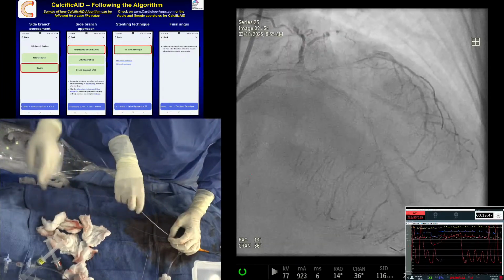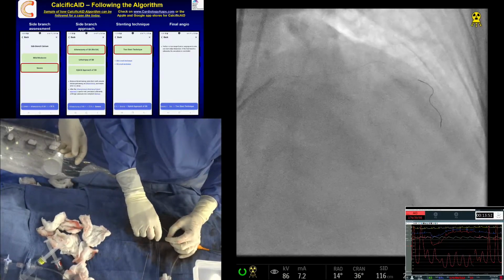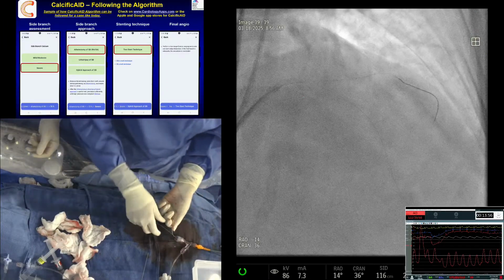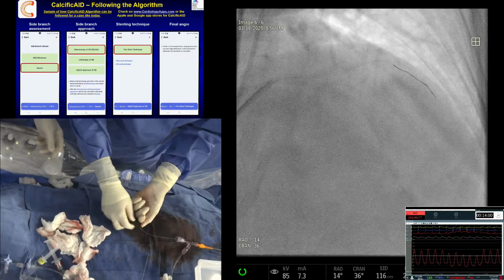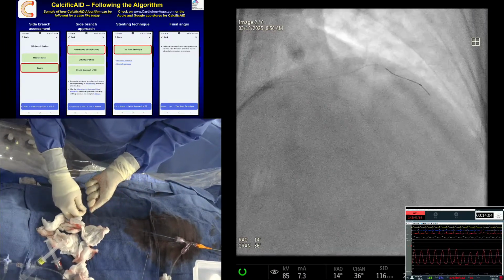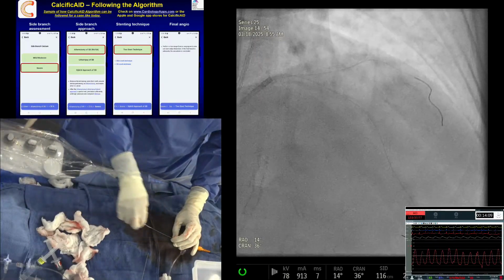The thing is, there's so much under expansion, the calcium is not fully expanded, and you don't want to put a two stent. The question is, do we come up to the ostium of the diagonal or not? That's where the question now is: do we make a mini crush, or just put a stent in the diagonal? Yeah, let's see this picture.